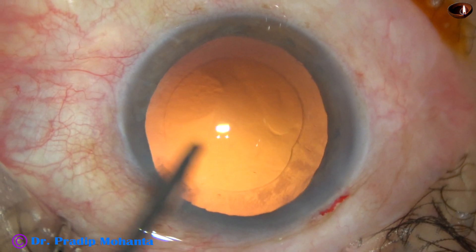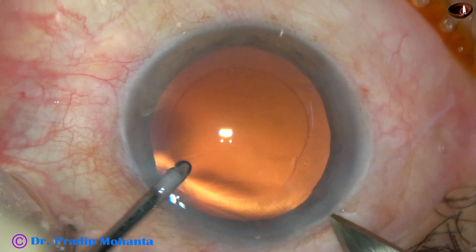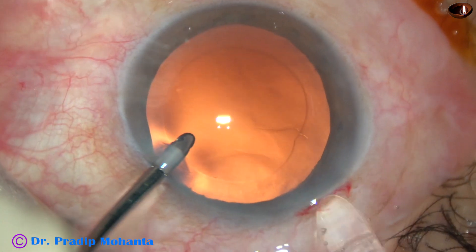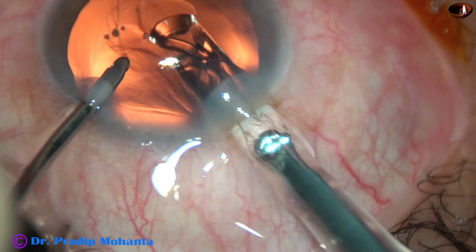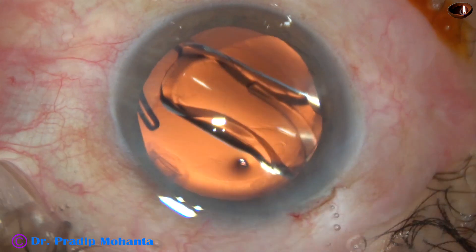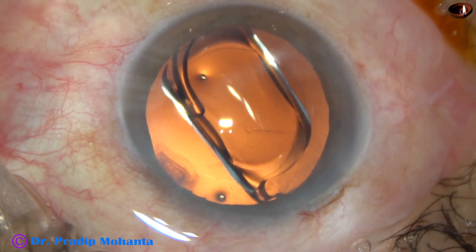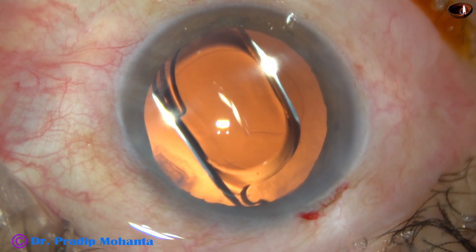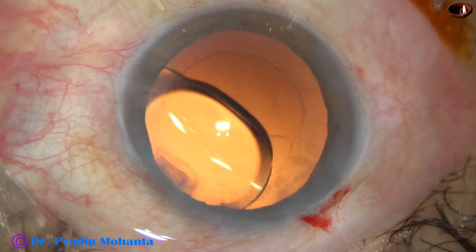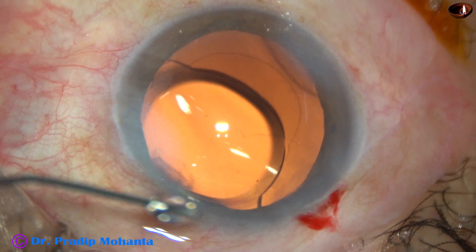Now is the time to implant an intraocular lens. I am going to use a B-cartridge, so I am enlarging the main wound to 3 mm. This is a hydrophobic acrylic single-piece monofocal intraocular lens — a beautiful lens. I have been using this lens for almost 10 years and I haven't seen glistening, whereas Alcon's AcrySof lenses develop glistening in 2 to 3 years.